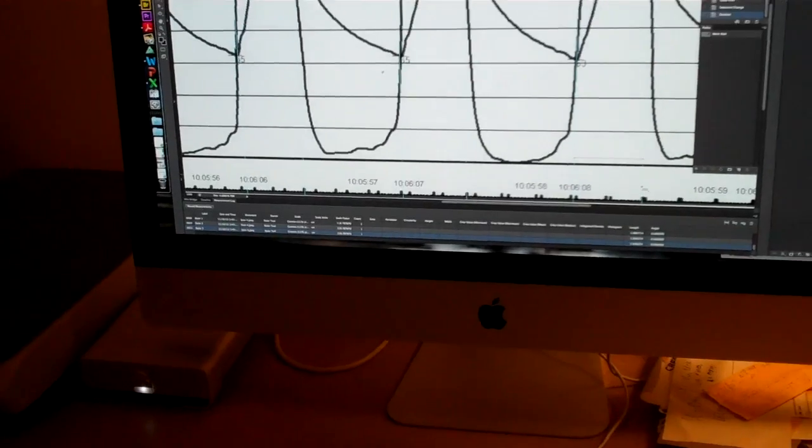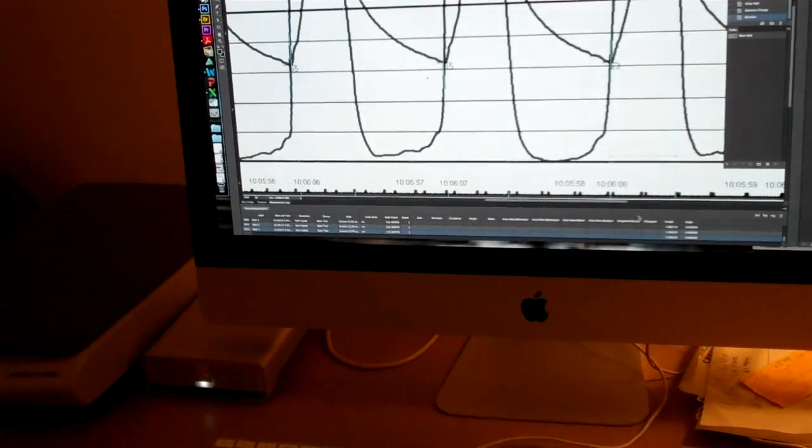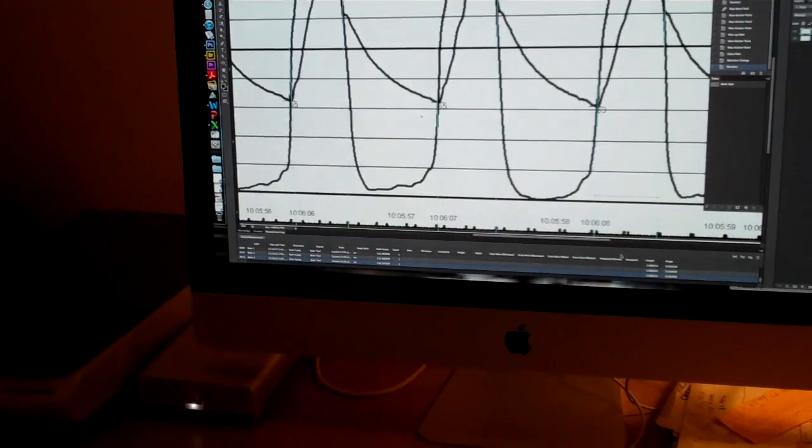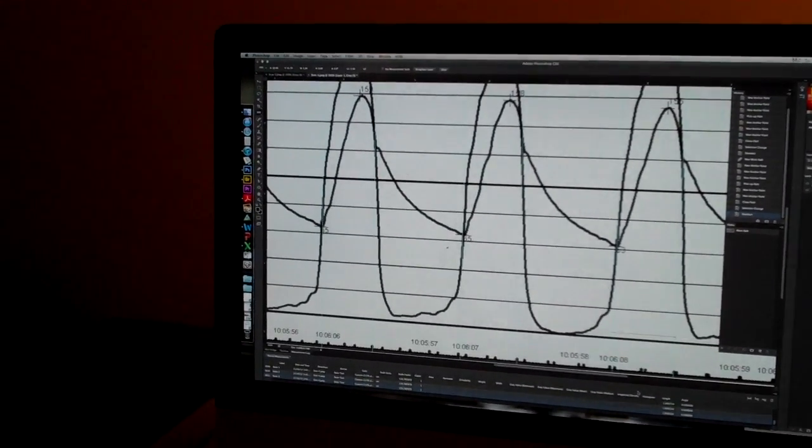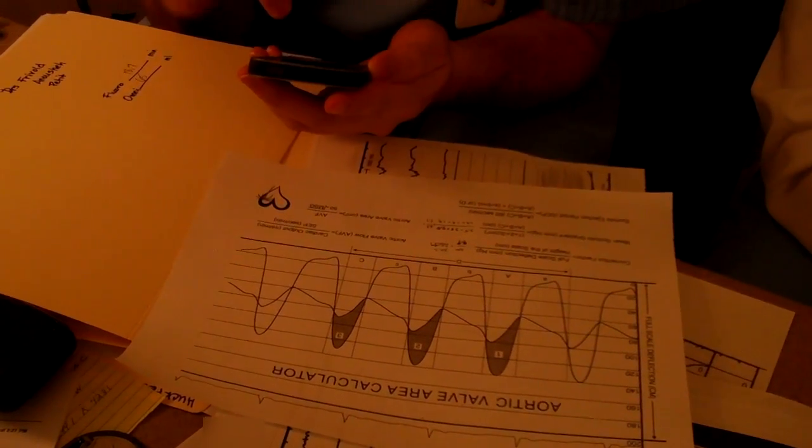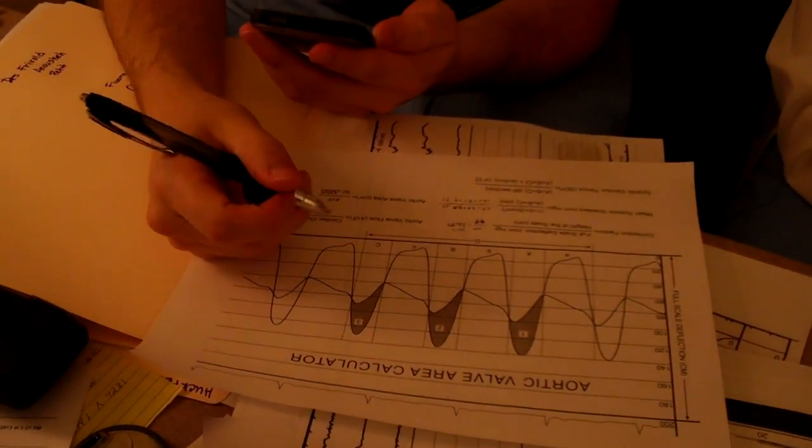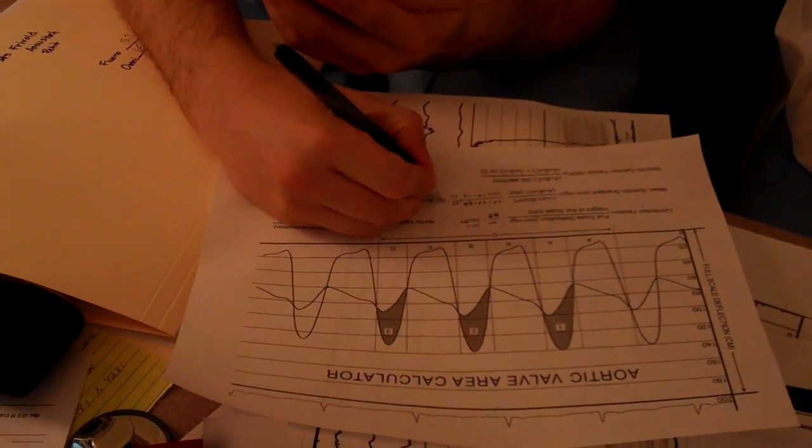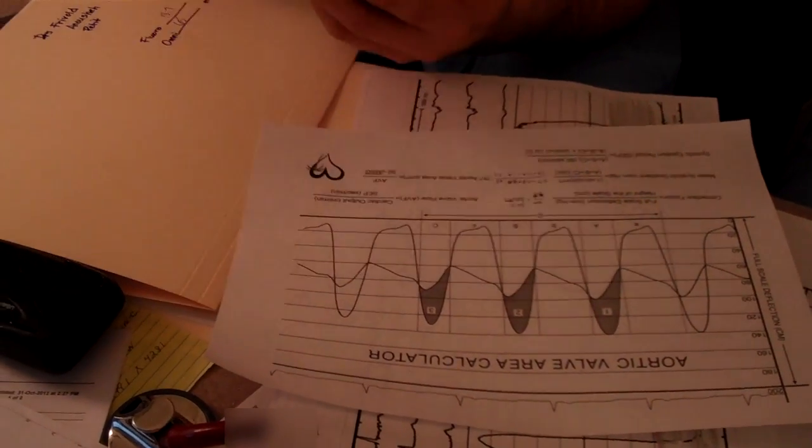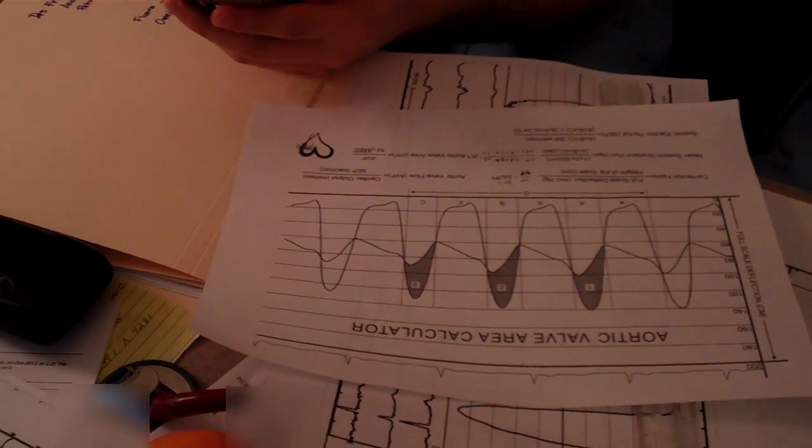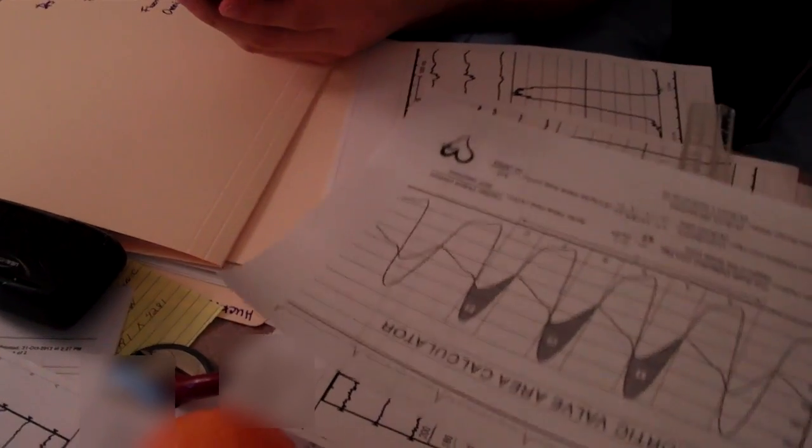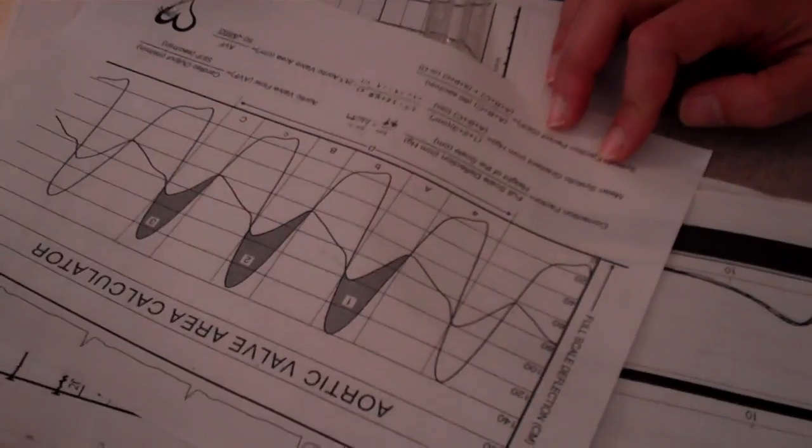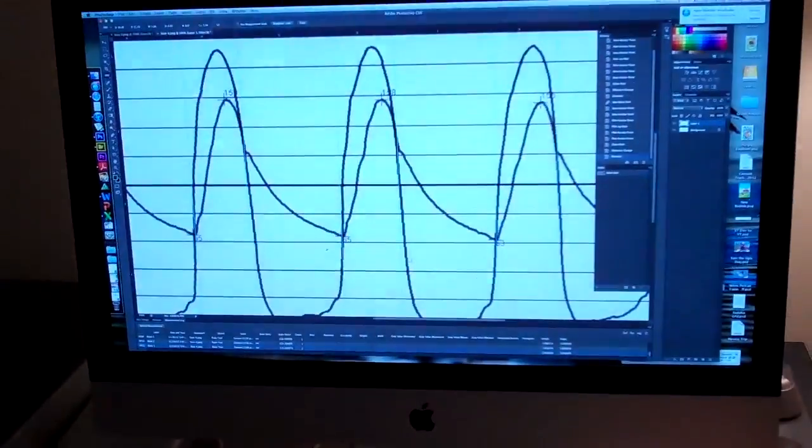So from that, systolic ejection period, be able to calculate the mean systolic gradient using the correction factor that came from measuring the full scale deflection and the information we just got. 29.4. That's the mean. That's almost 30. That seems reasonable. And the peak to peak is 35. So this looks like about a 30 millimeter mean systolic gradient. That's not bad.